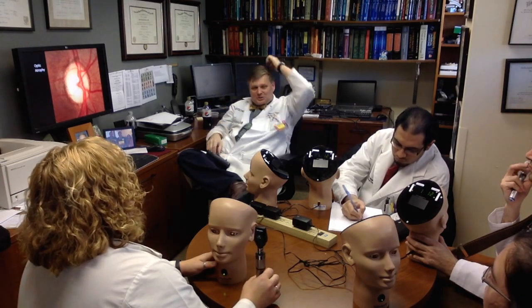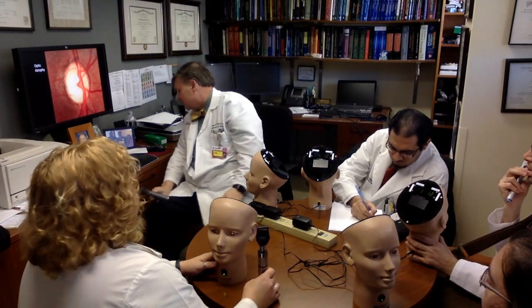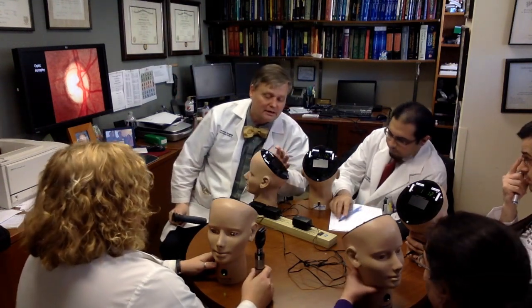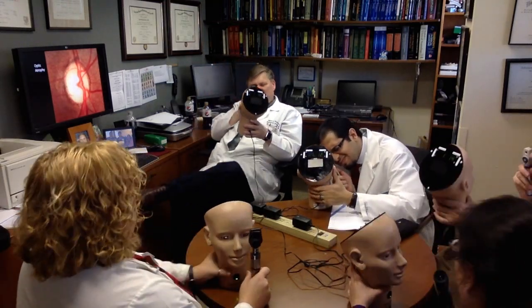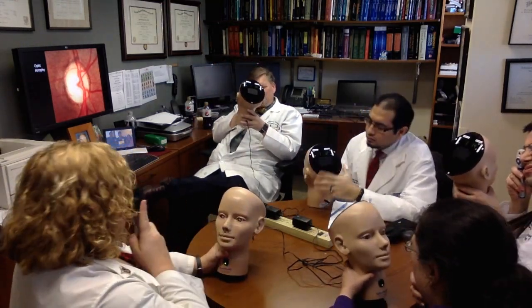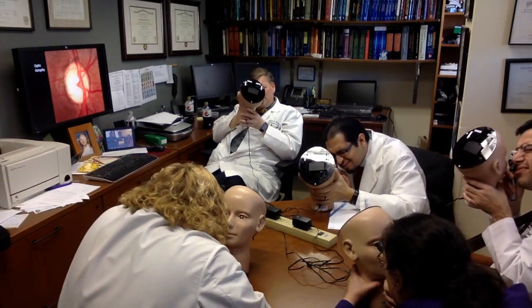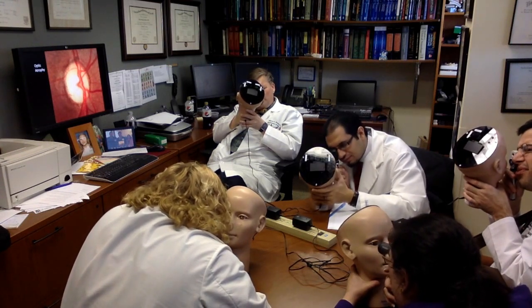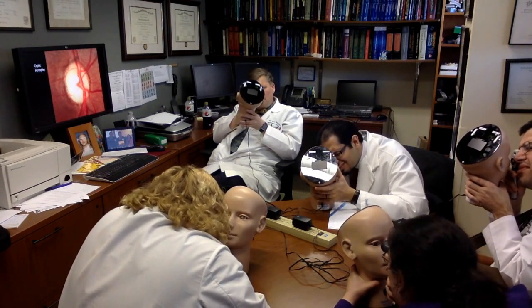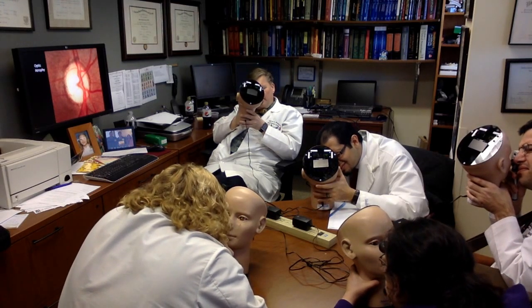of nerve tissue. But yeah, end-stage glaucoma causes optic atrophy. Okay, so let's look at number 14. Turn to 14. Good. Focus 10 feet away. Come in at 15 degrees. Come in, come in. And then focus on the disc. And what do you think of the disc? It's pale. This is optic atrophy again.